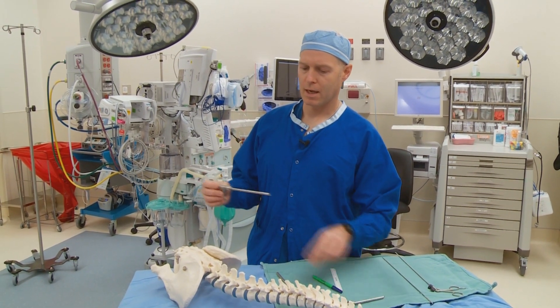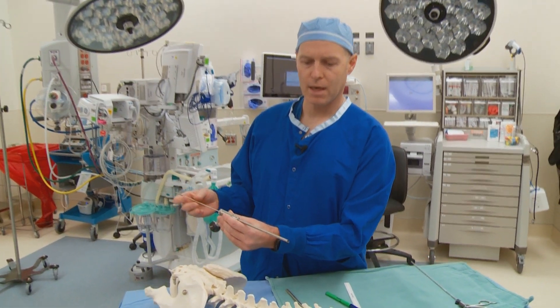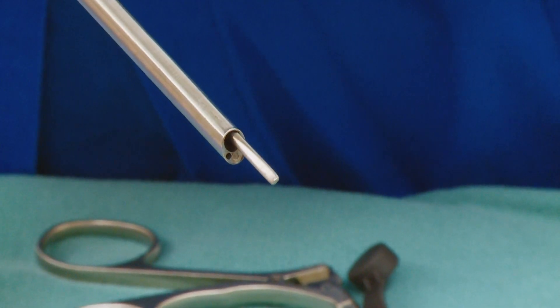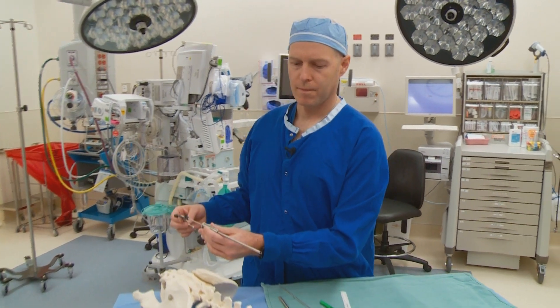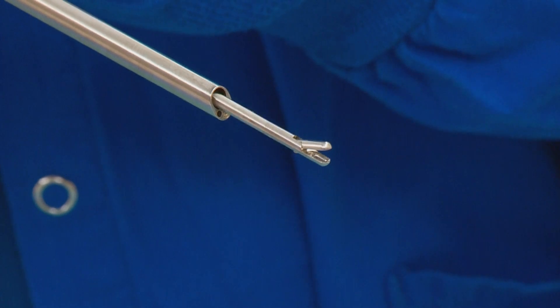That endoscope also has a working channel down the center of it that allows you to manipulate tissue. You can see this is a dissector, and then also things like graspers, which look like that — those can remove tissue. And then there's also a series of drills and things like that.